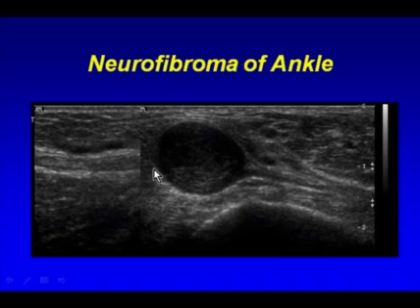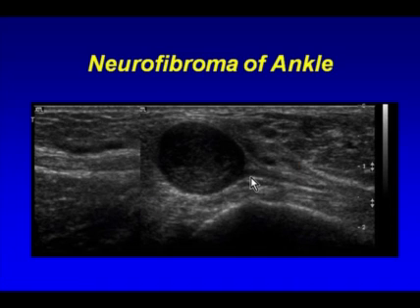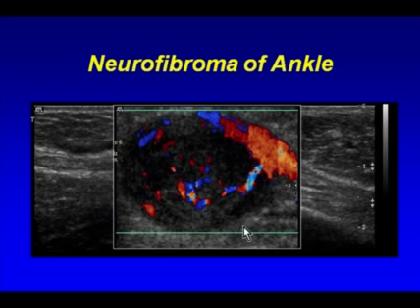Here's a more extended field of view of this same lesion, and showing, first of all, the nerve coming into the lesion and exiting it, but also showing the Doppler flow that can be seen in nerve tumors.